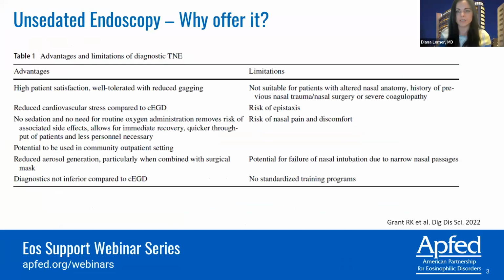And so one of the questions we have to ask is, why offer unsedated endoscopy? And I think Dr. Rubinstein and Dr. Menard-Katcher have made a really good point that the high burden of endoscopy in individuals with esophageal disorders lends itself really to better methods to investigate esophageal disease. And unsedated endoscopy has definitely received a lot of traction, as I will show you, in the past, but also much more recently. So, the advantages and limitations of this approach.